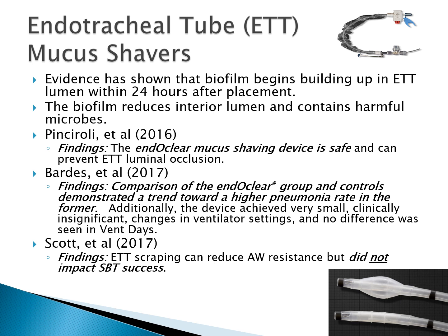The strategy of using a mucus shaver has been studied, not heavily, but it's certainly been studied. So we know that within hours after intubation, there's a biofilm that starts to build up on the inside of the artificial airway, the endotracheal tube. And that biofilm can do at least 2 major things. One of them is it can get thick enough to reduce the inside lumen of an artificial airway. Many of you have taken out, let's say for a trach tube, the inner cannula, and you see all that crap that's sometimes caked up inside of it.